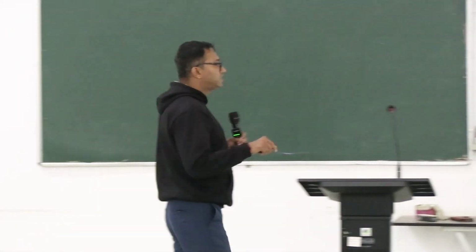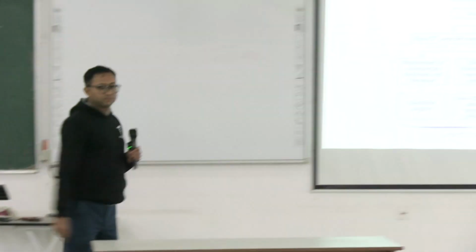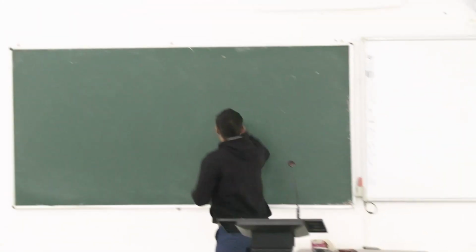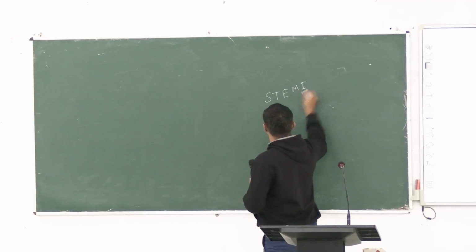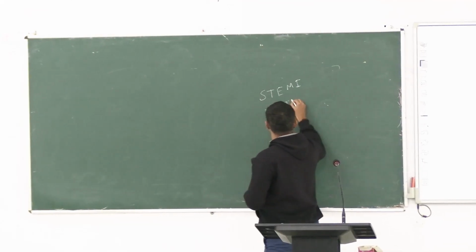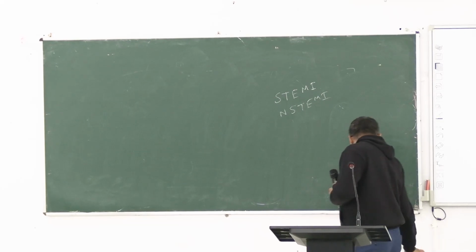It may be depressed or it may be elevated. We call it non-ST segment elevation myocardial infarction and ST segment elevation myocardial infarction, that is NSTEMI and STEMI, right?